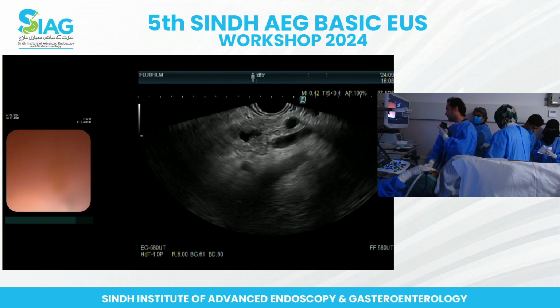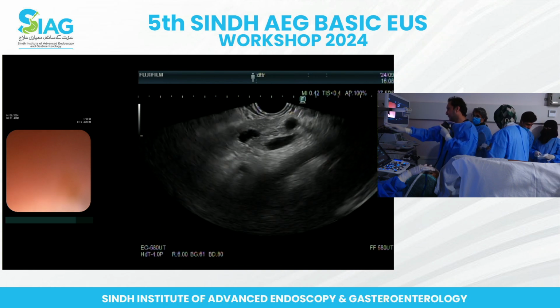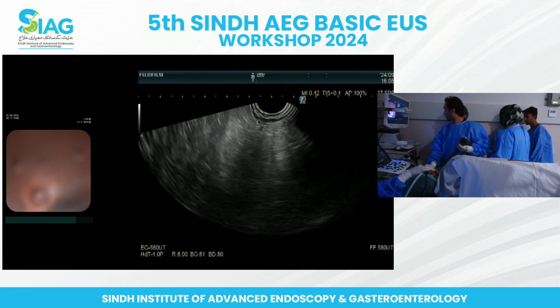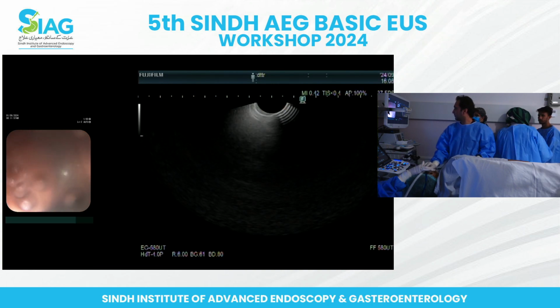Heterogeneous, hypoechoic. That's the aorta, that's right. Do you want me to go ahead? Gigi, please go ahead. Why not? You're doing so well. Just go to the GOJ and let's find it again.